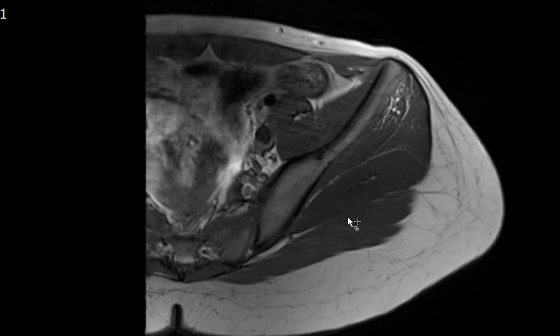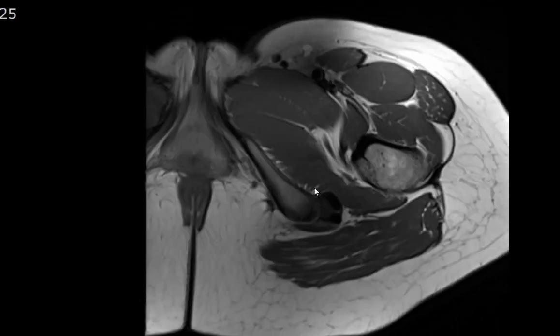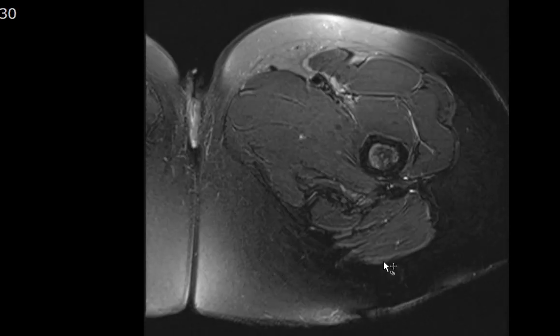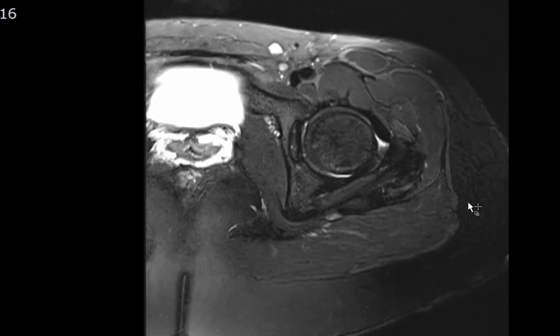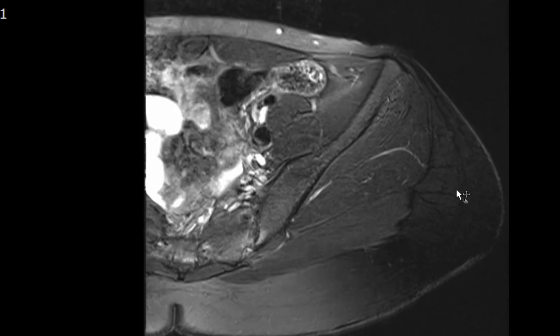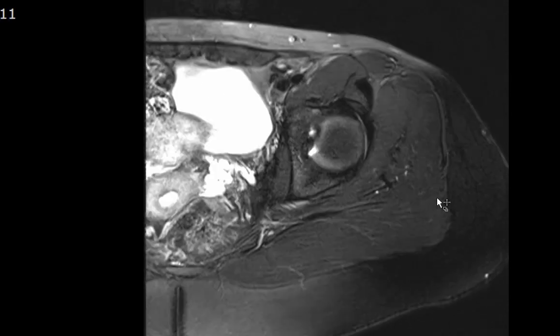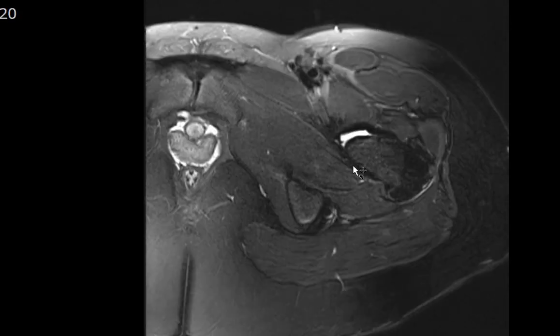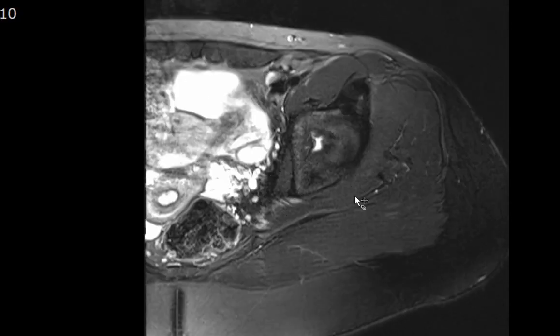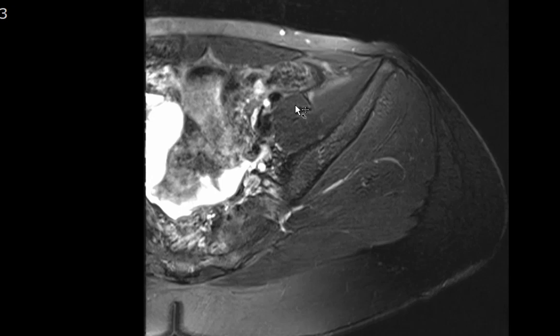Finally, looking at the subcutaneous structures confirms no masses and no edema — the subcutaneous tissues appear grossly intact. In summary, the MRI evaluation of the hip covers osseous structures, cartilaginous structures, intra-articular structures, the labrum, all tendons, the muscles, the intra-pelvic contents, and the inguinal region. Thank you so much for your attention.